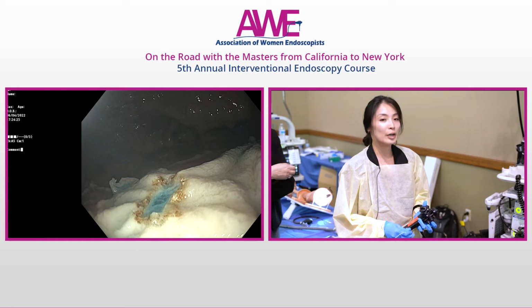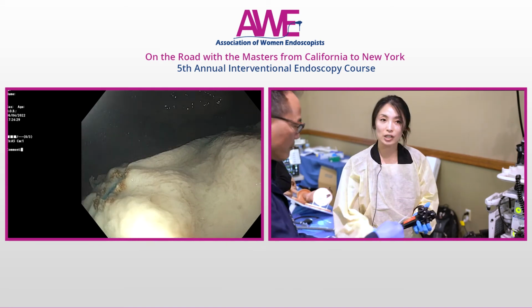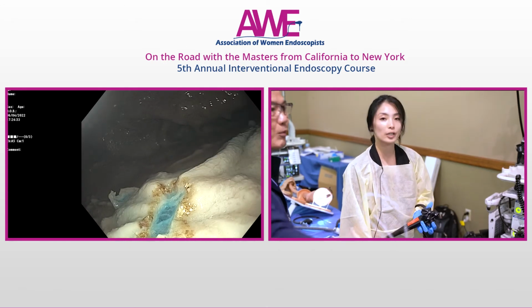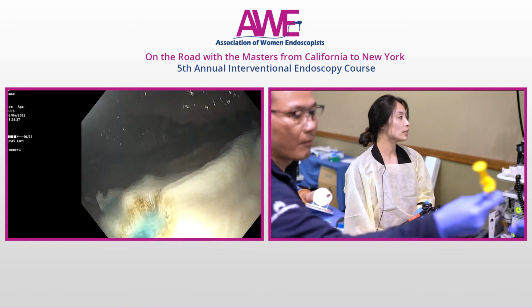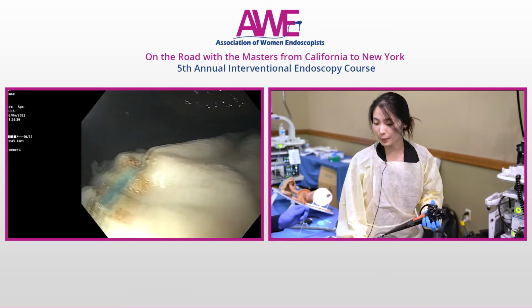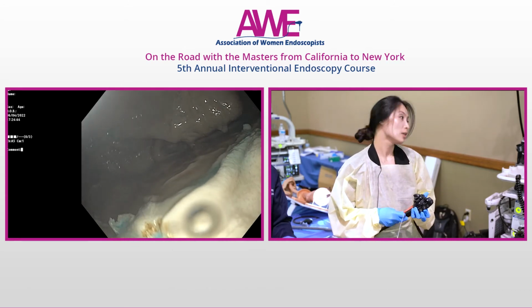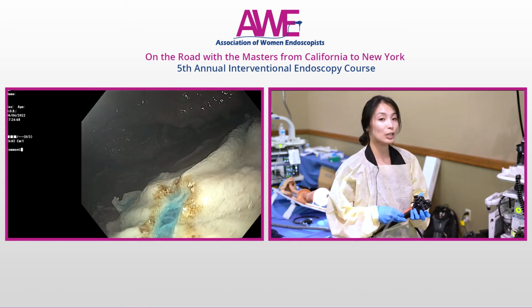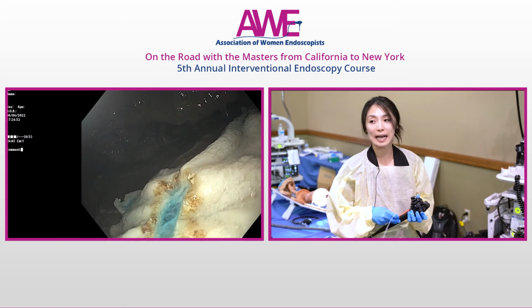So, in patients who are at high risk of bleeding, if they're on anticoagulation, or if this is a big defect, and especially if you're sending the patient home, which we do for most of our patients, we want to close the lesion, and there's a few options for closure. Obviously we have clips, but there is also this Purostat gel. So this is a hemostatic gel, and it forms a matrix, and it activates actually on contact with blood.